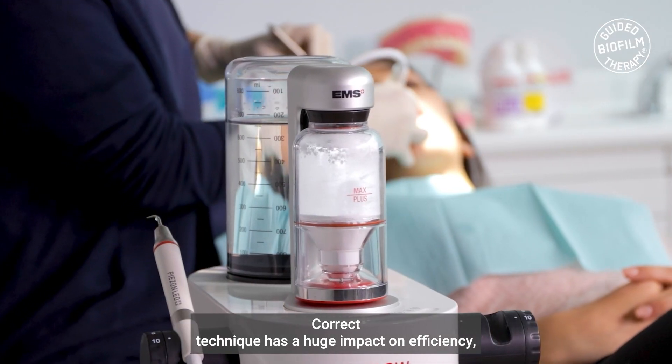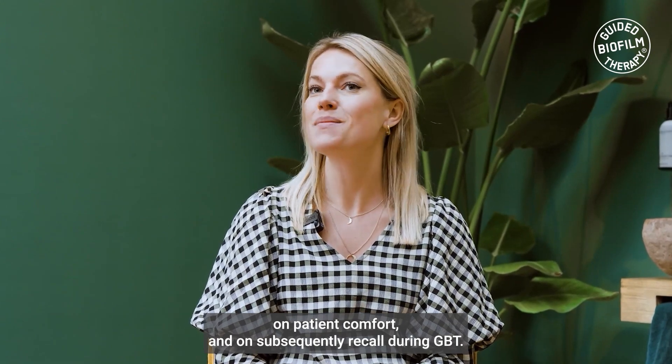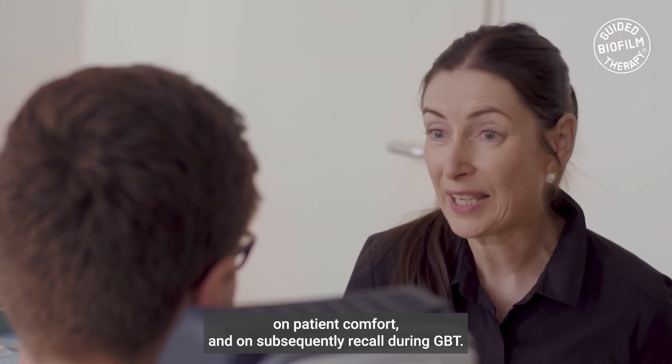Correct technique has a huge impact on efficiency, on patient comfort and on subsequently recall during GBT.